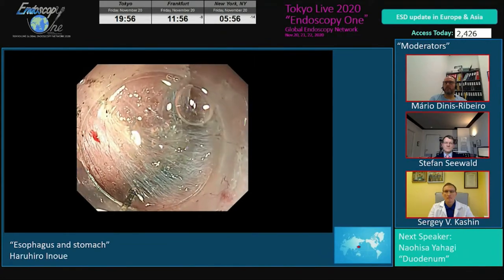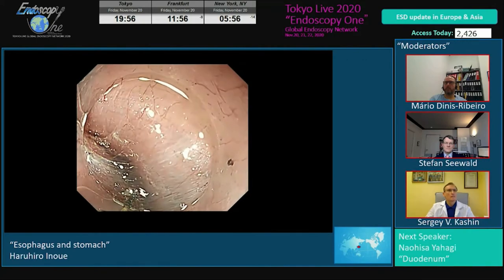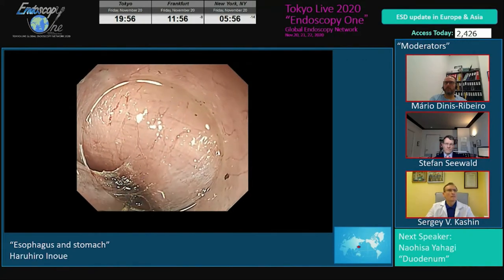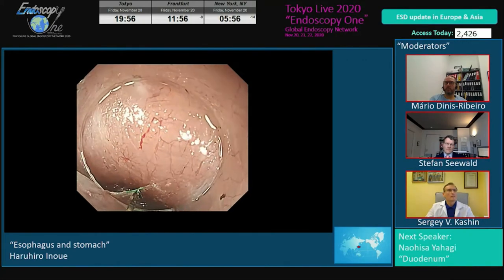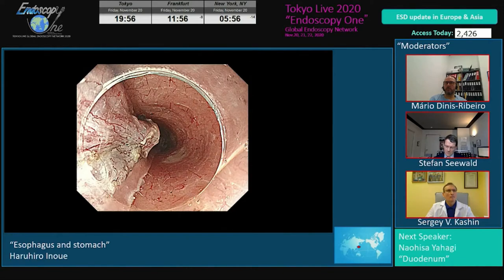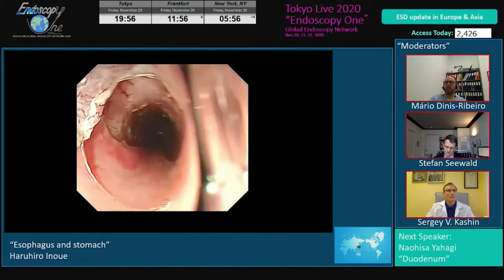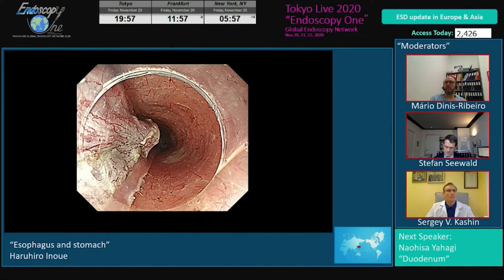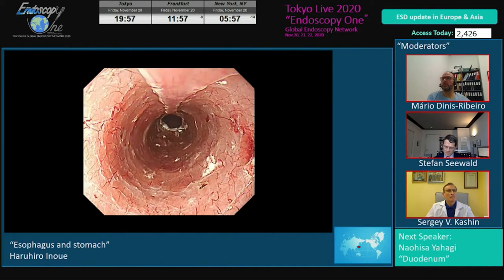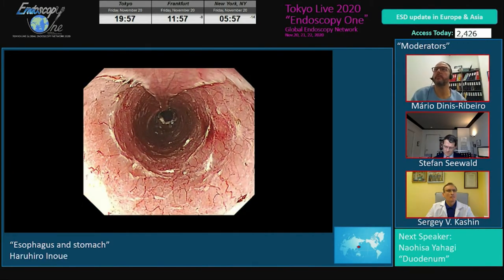At the very end of the procedure, because the specimen becomes floppy, without traction it's difficult to continue dissection. But as long as we keep the traction, we can do it. The specimen is out, nearly circumferential. ESD has been done without any trouble.